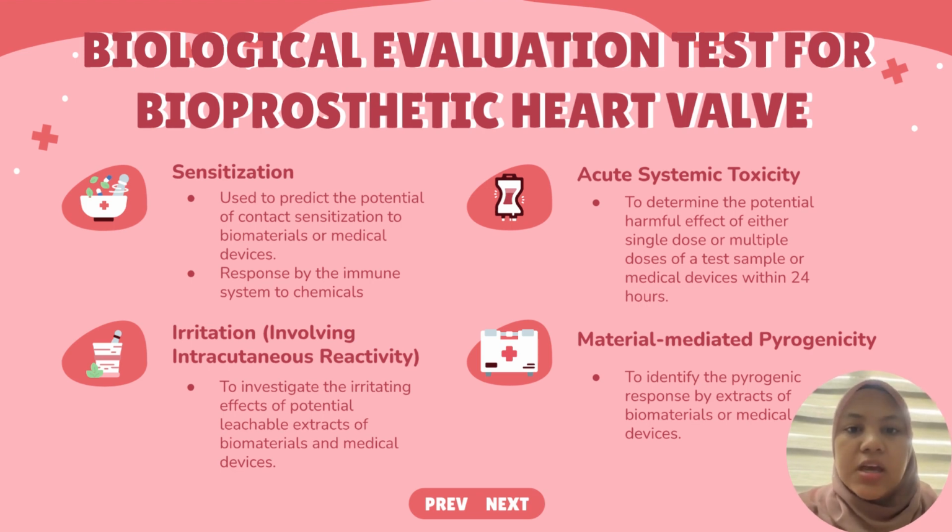The second one is irritation, involving intracutaneous reactivity. It is to investigate the irritating effect of potential leachables in extracts of biomaterials and medical devices. Number 3 is material-mediated pyrogenicity. It is to identify the pyrogenic response caused by extracts of biomaterial or medical device.